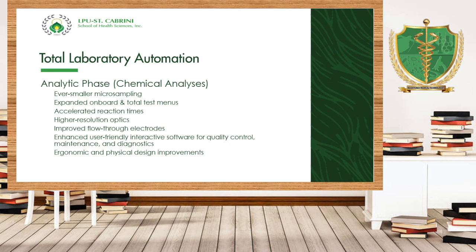How about for analytical phase? Analytical phase is also known as the chemical analysis. And this includes very smaller microsample, expanded on board total test menus. Yun yung test mismo, no? Na mayroong mga iba't ibang principle on how to do the test. And take note, no, that it should be ergonomically and physically designed improvement. And of course, dapat user-friendly. User-friendly interactive software for quality control and maintenance.